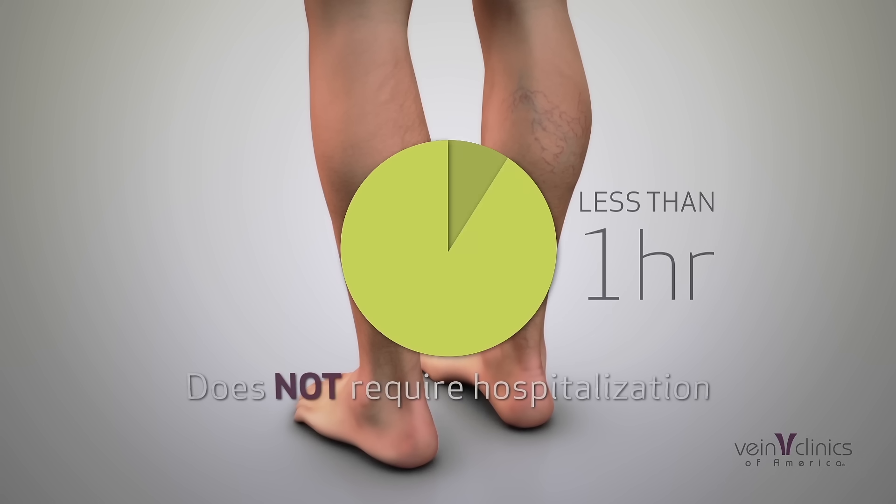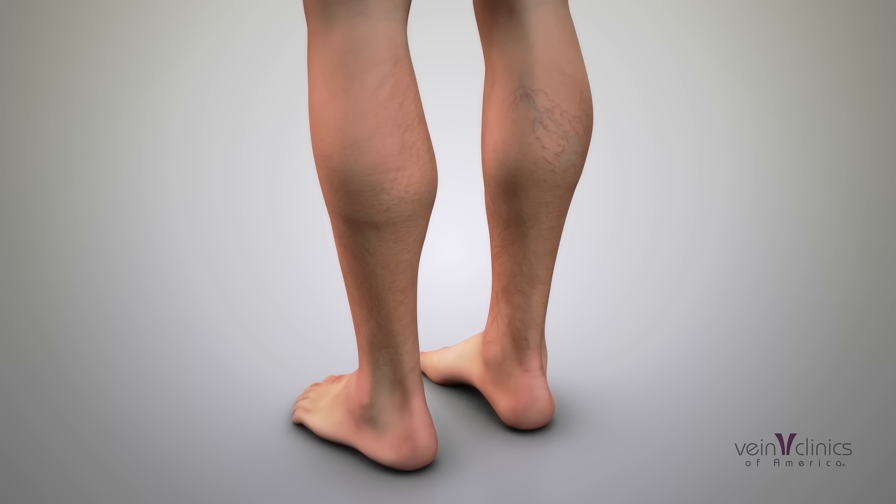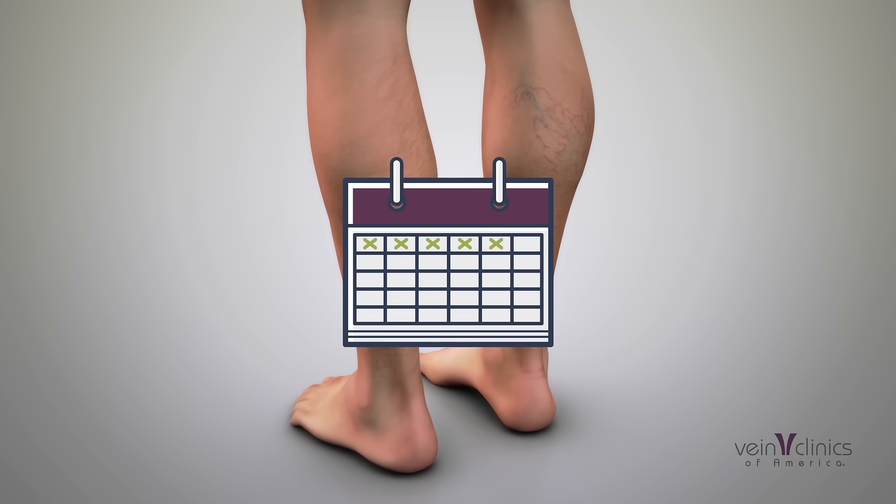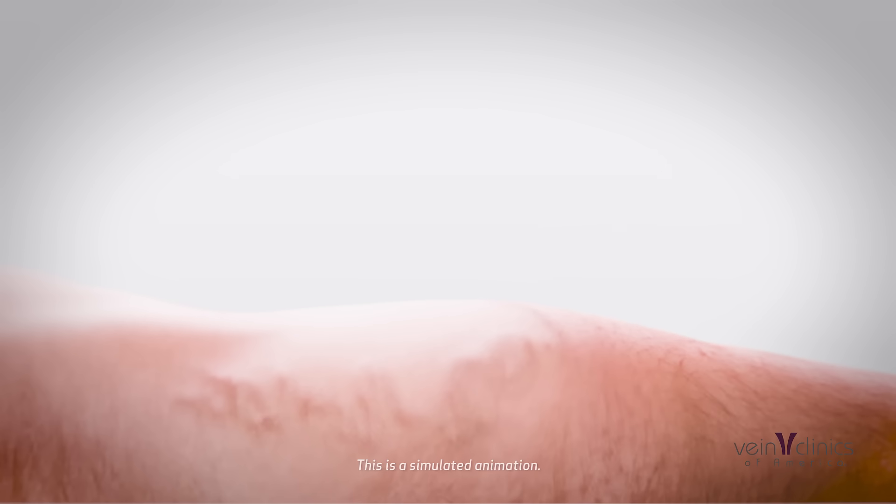It does not require hospitalization. While some discomfort may be experienced after treatment, typically the discomfort diminishes within a few days. The procedure is always performed under ultrasound guidance, giving the doctor a live view of your vein for accuracy and safety at all times.